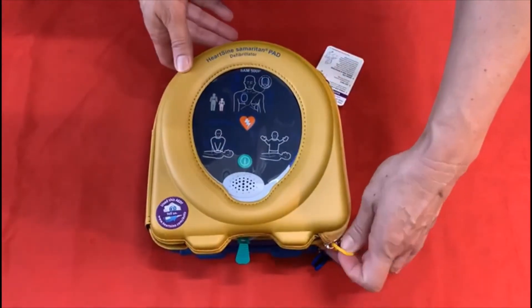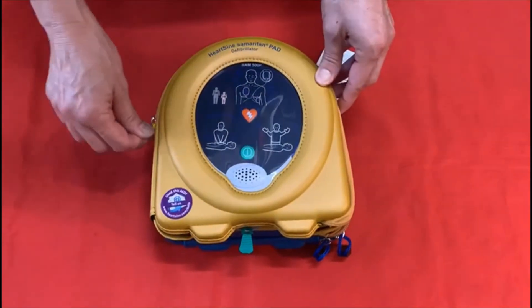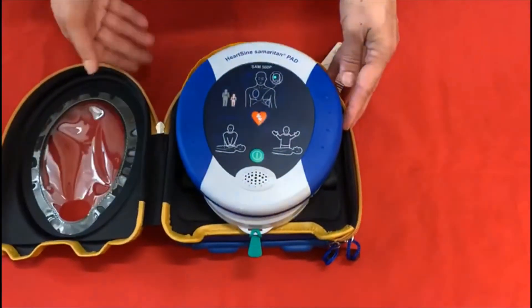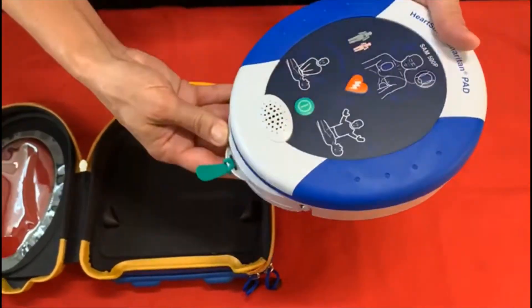Firstly we'll start by removing the defib from the case. Simply unzip the case. Then we're going to remove the cartridge at the base of the defib.